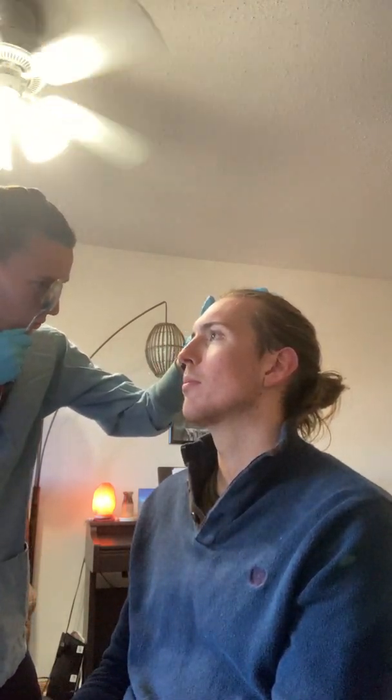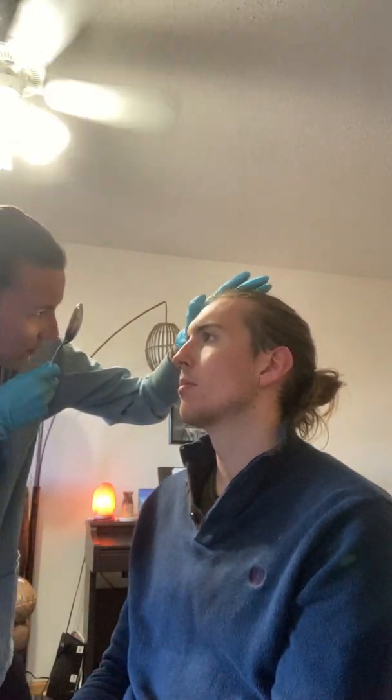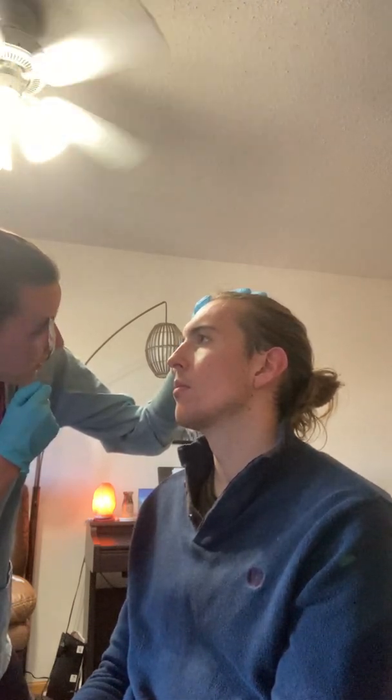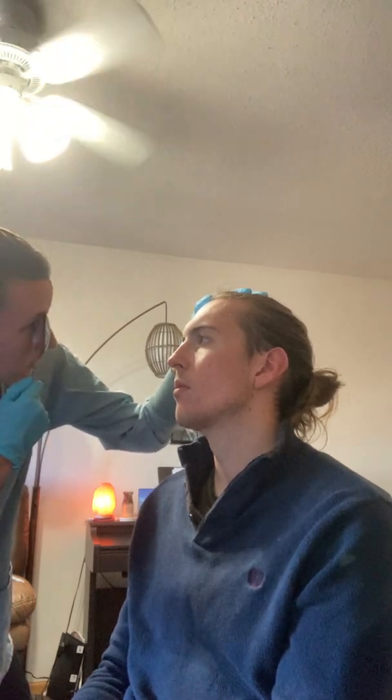And I'm just going to look as I move my head and my scope together, looking for your red reflex. And then once I get in and find that, I will zoom in a little bit more. And I'm noting your optic disc, and that it is pink and orange in color. It is oval in shape. It has good, intact margins, and I see your vessels.